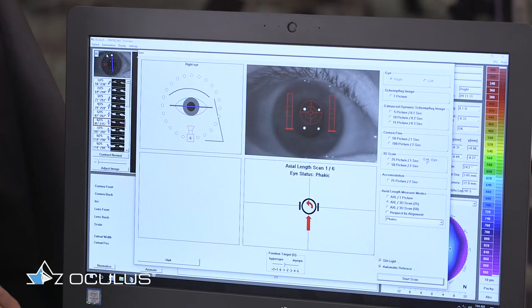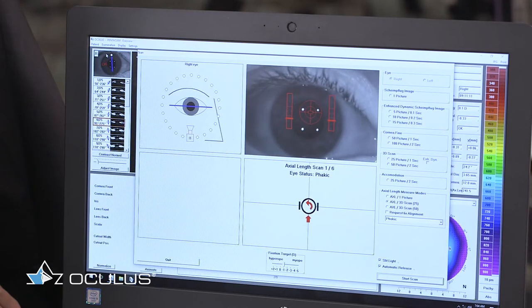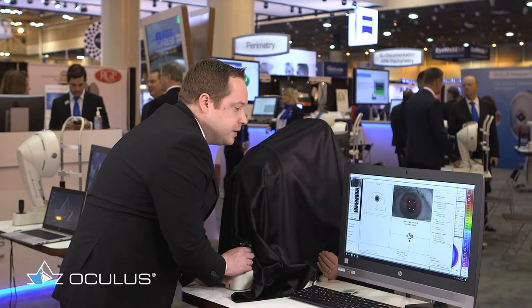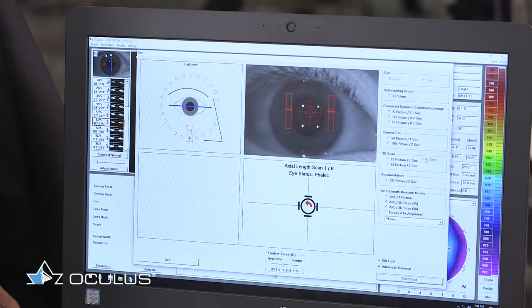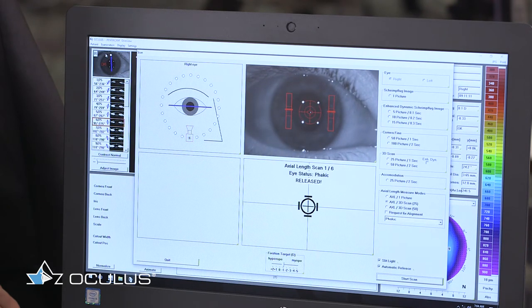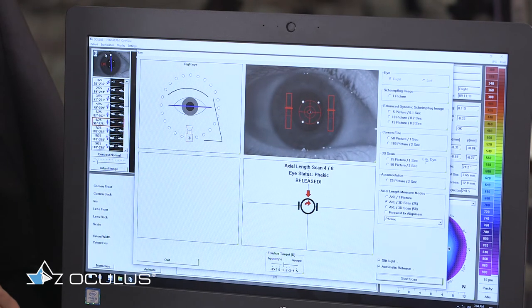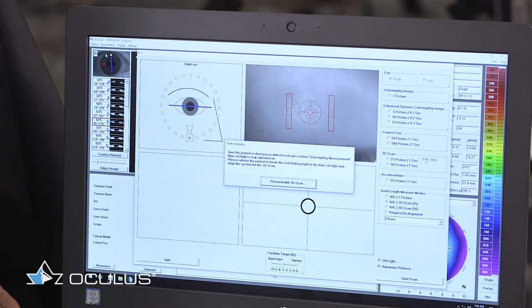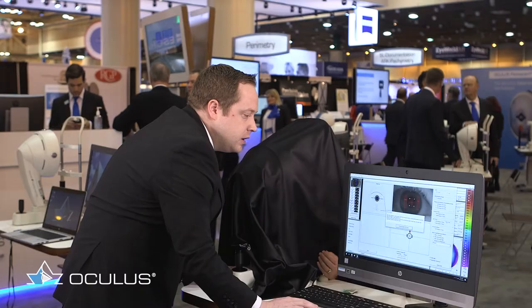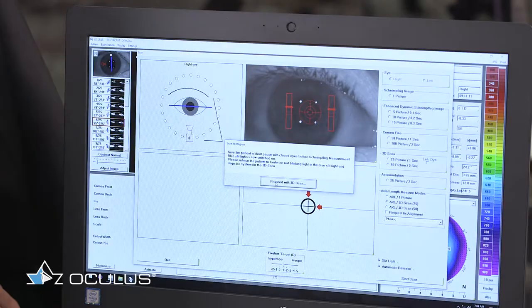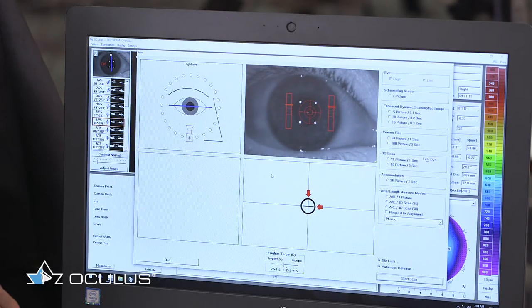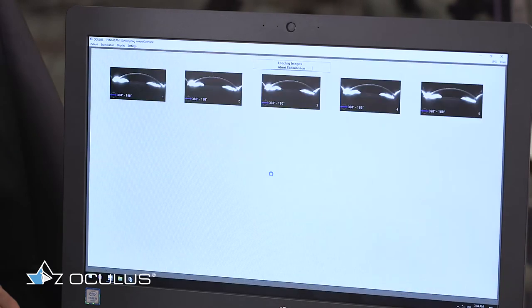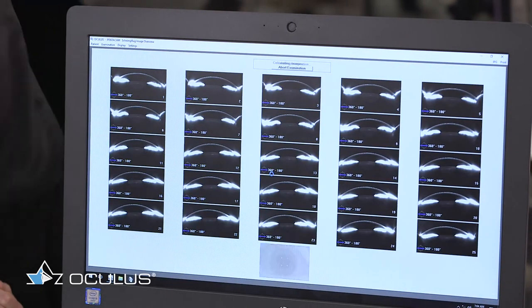I'm just lining up the device and the nice thing about this is once I have the proper alignment the device will automatically start the scan. Now the device is taking the axial length measurements. It actually takes six axial length measurements in succession. And now I'll proceed with the high resolution Scheimpflug scan. Now the scan is complete.